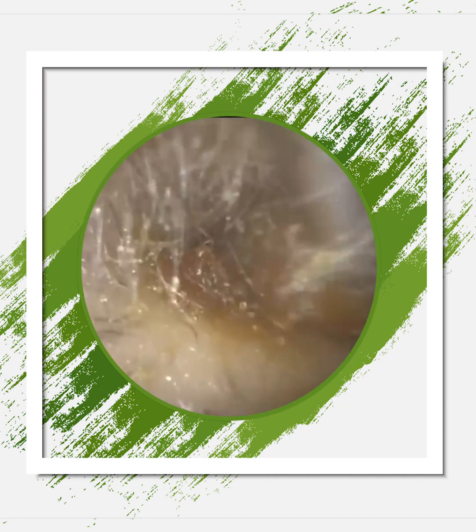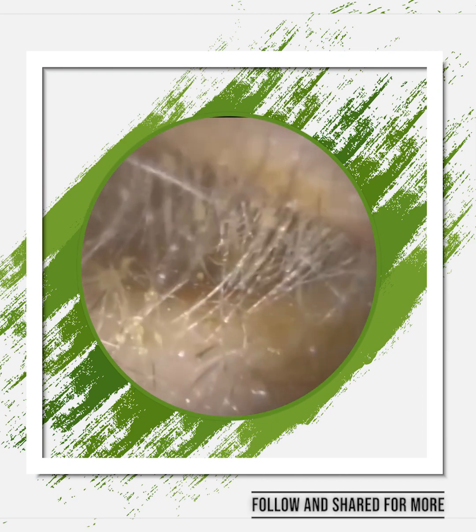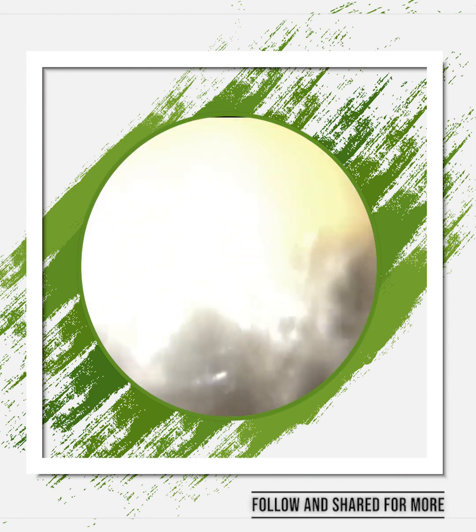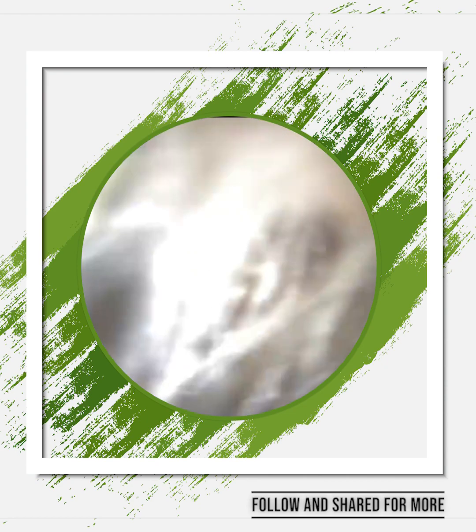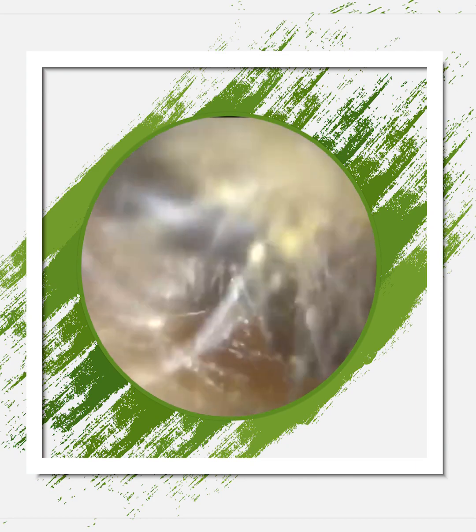And it was a bit of a struggle, actually. I think to tease this out from the bendy ear, I had to resort to an ear hook and then a Jobson horn. So I'm just getting the hook. There's a few hairs there which didn't make it any easier, made it a bit more tricky. And this is why these procedures can be tricky in cases like this, especially for someone who's learning the technique.